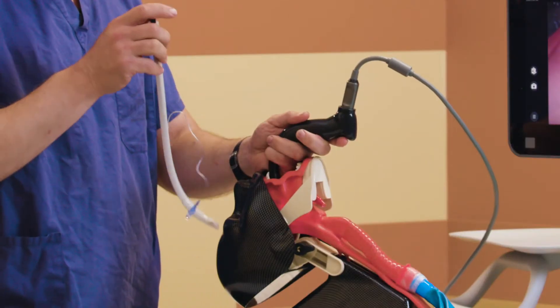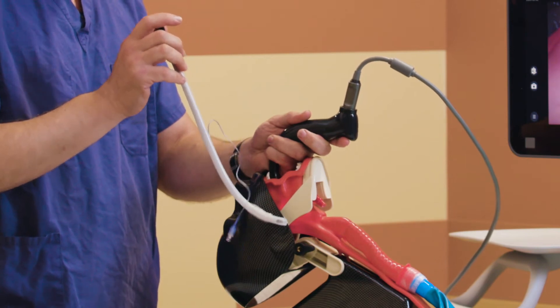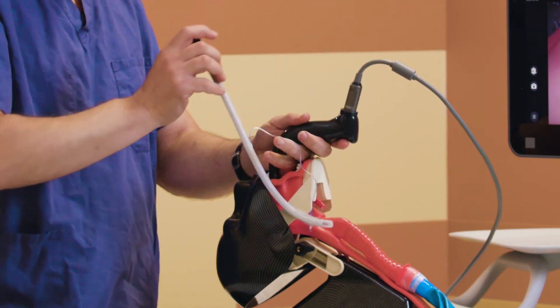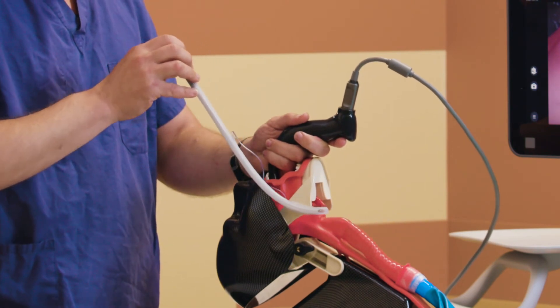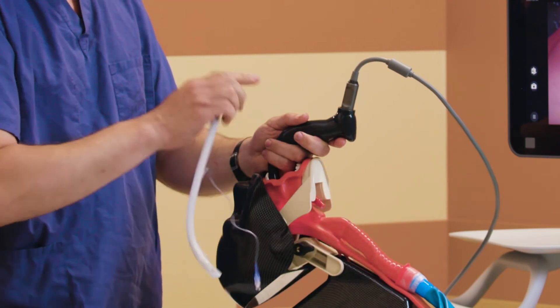Let me explain the rationale for the rightward turn that I make with the rigid stylet. I am following around the curvature of the blade, and if I were just to try to advance this into the trachea, you can see that the rigid stylet and tracheal tube is pointing upward, but the trachea points down.